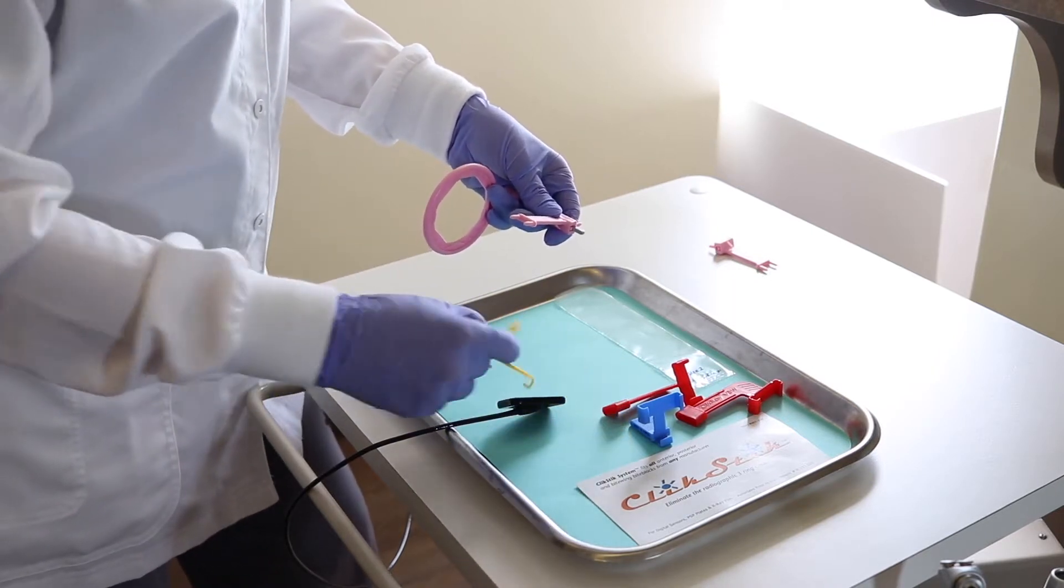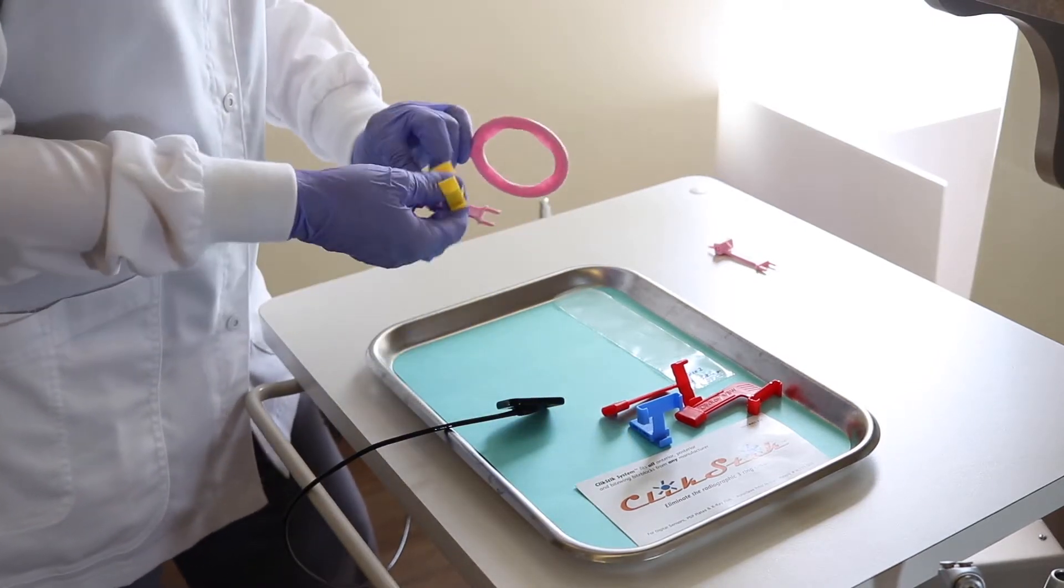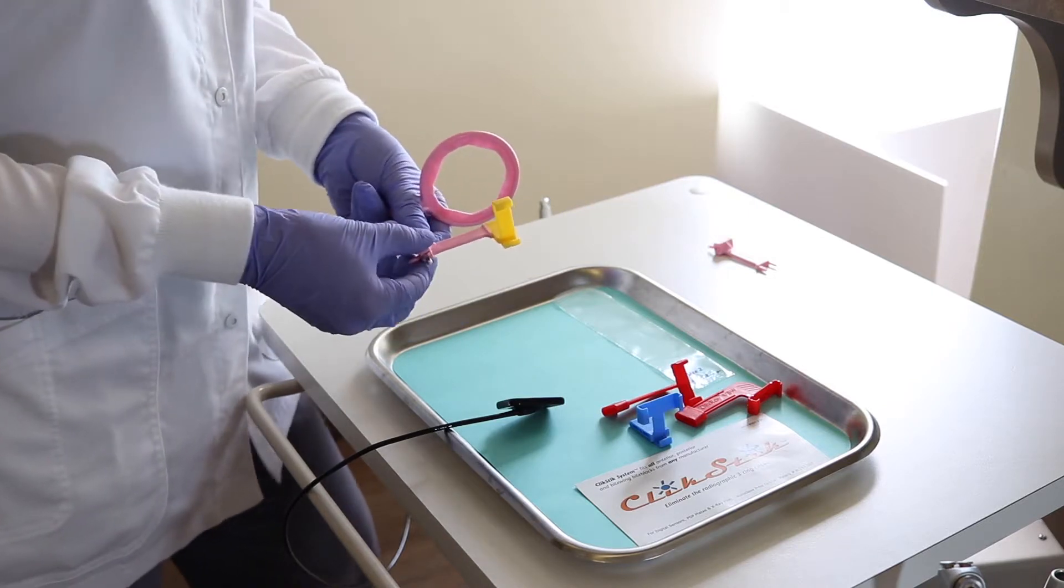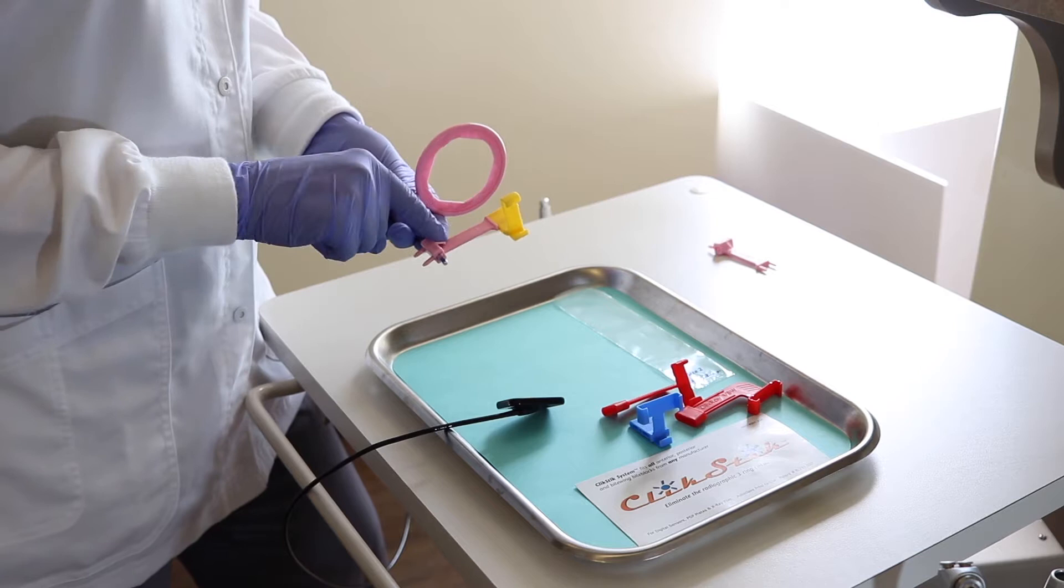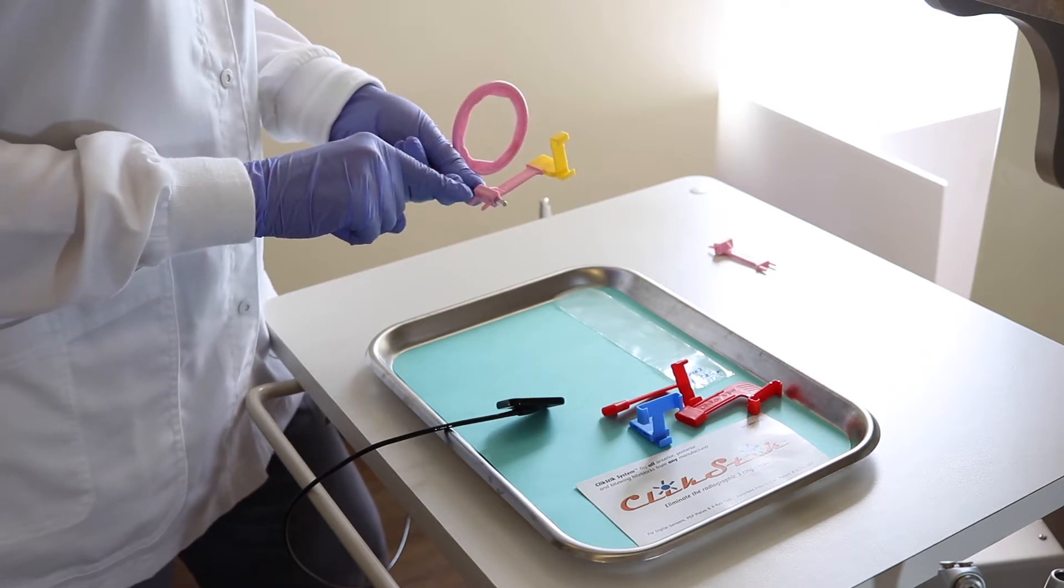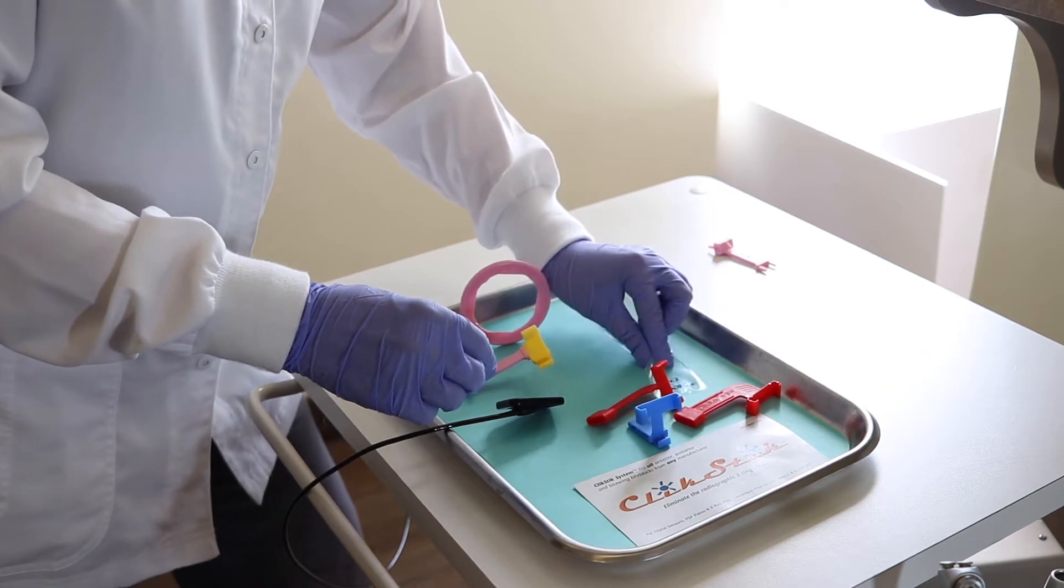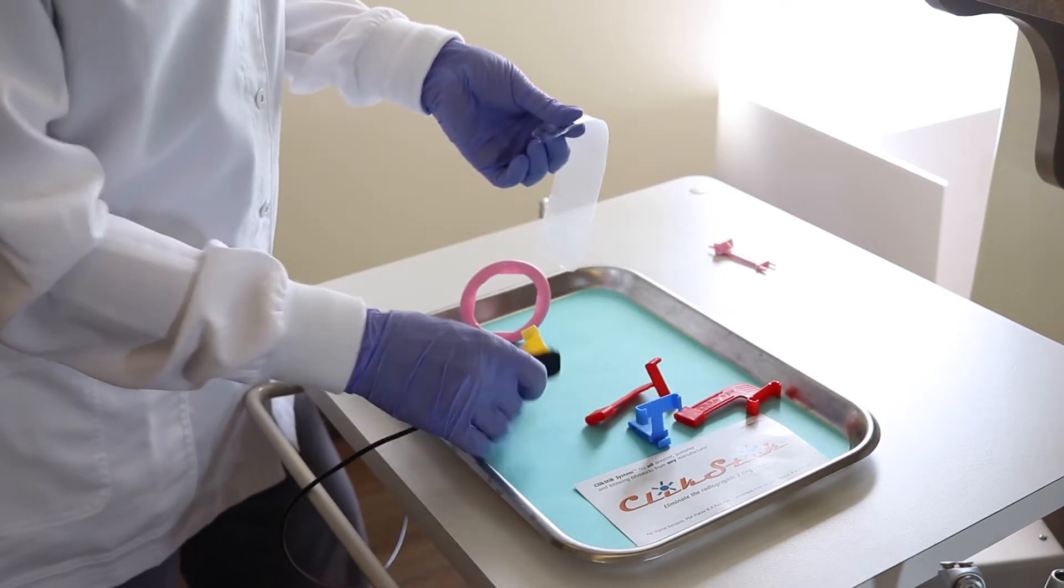So how you go ahead and set this up is by just placing your posteriors and your anteriors onto the long edge of the stick and when we flip it over I'll show you how to use the other side of this to use your horizontal and vertical bite wings.